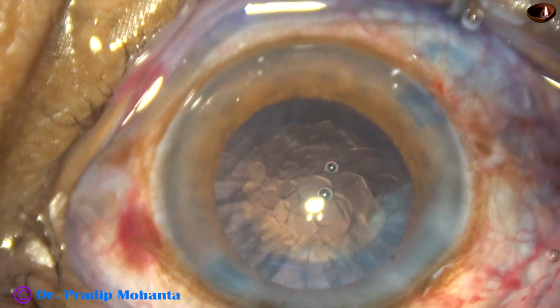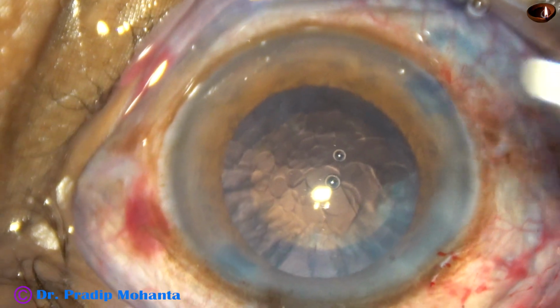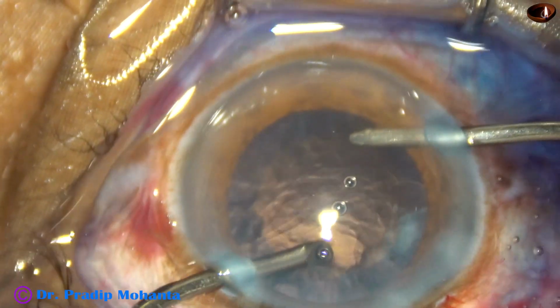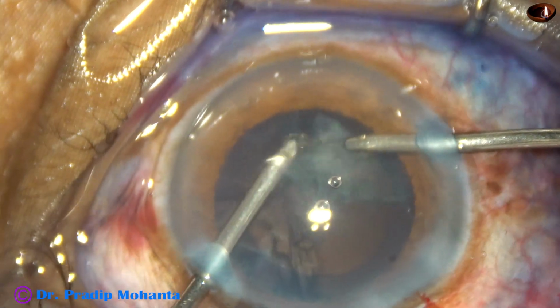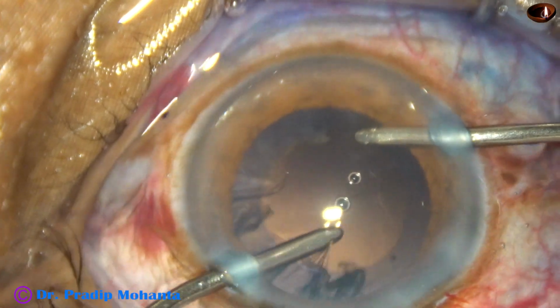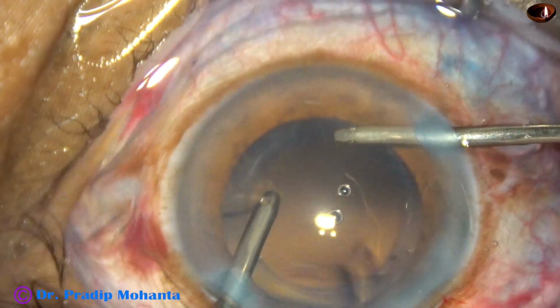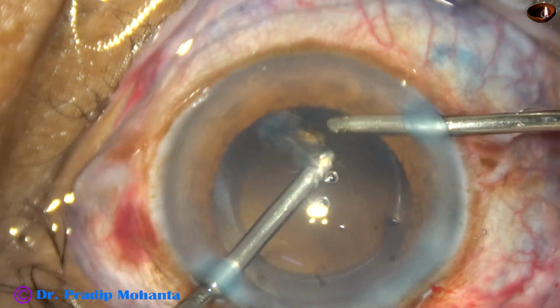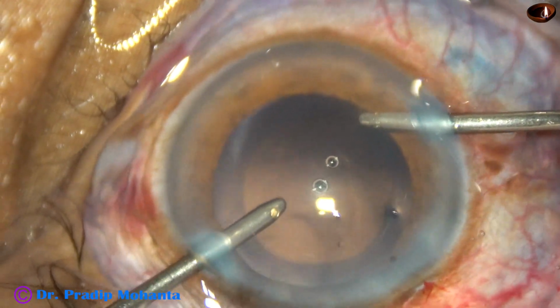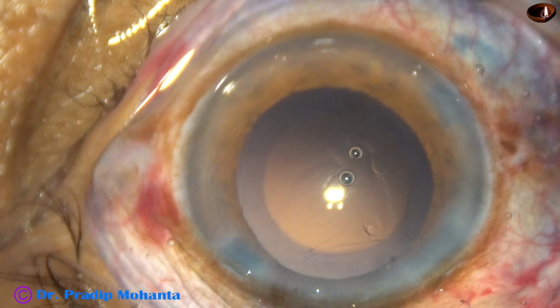I'm going to use bimanual irrigation aspiration for removal of cortex in this case. The irrigation is from the right side, aspiration from the left, and see how easily the cortical matter is coming to the aspirating port. And in this case I didn't have to change hands. I could remove all the cortex from the left side port. Yes, so all the cortex has been removed.